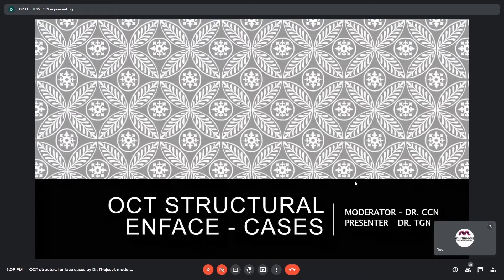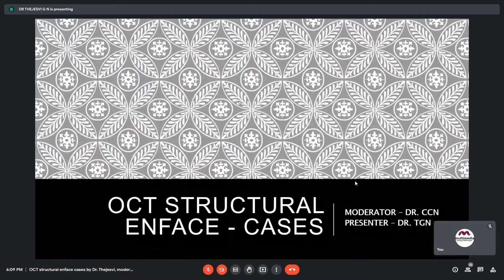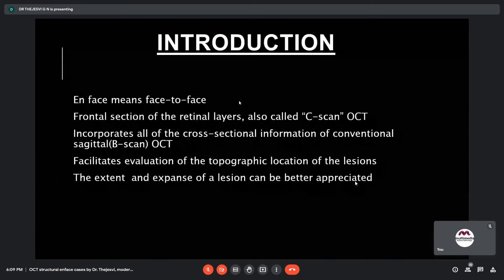Today's presentation is an en-face OCT-based case presentation. We will cover the basics of en-face OCT, the OCTA labs, two cases, and artifacts in OCTA.